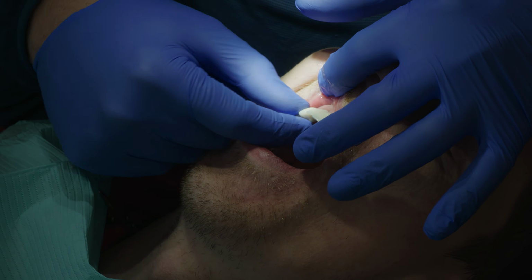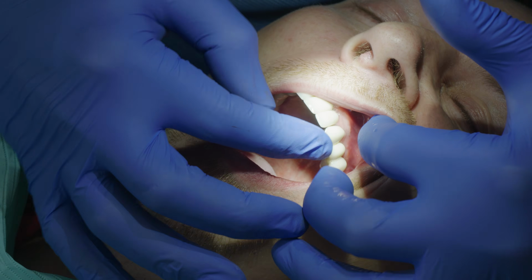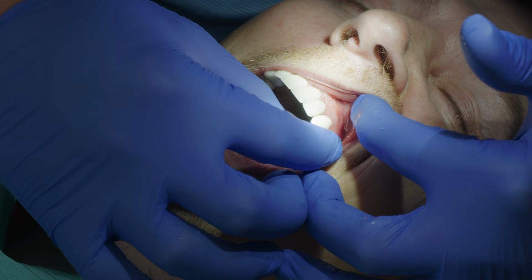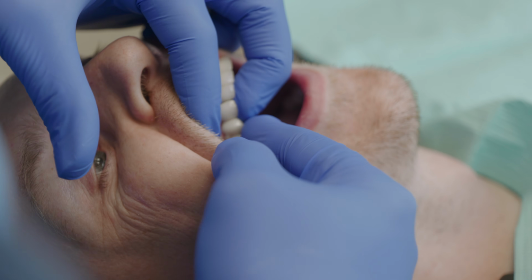There we go. This case was prior to the photogrammetry technology coming out, before we could start doing everything screw retained with the monolithic zirconia. So, big words pretty much saying that with the advent of all the coolest, latest, and greatest technologies, we've been able to make these stronger and sturdier so that we don't have to worry about them coming loose as often or having those types of problems. Getting rid of the cement makes it so the implants can all heal up better.